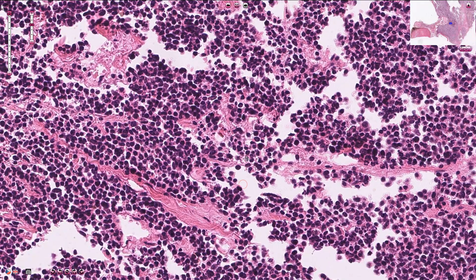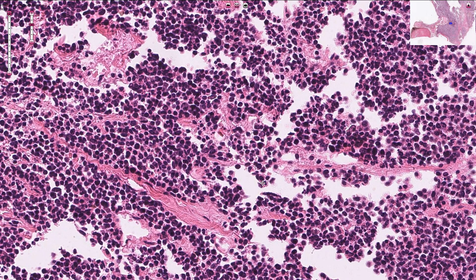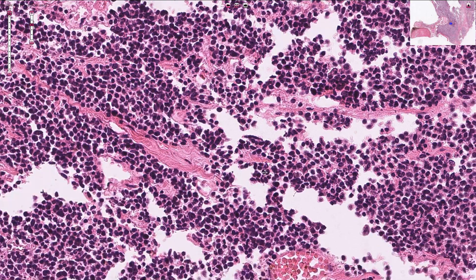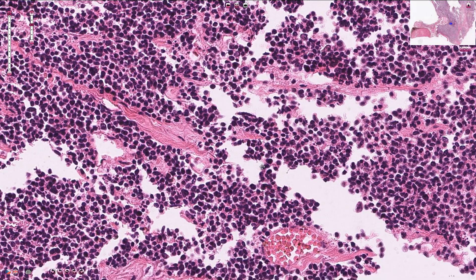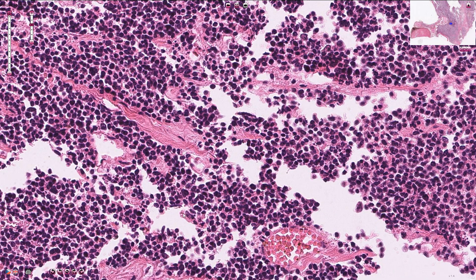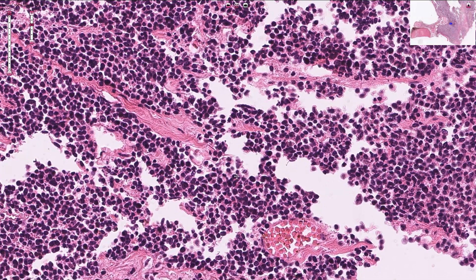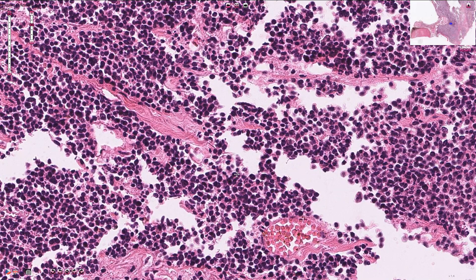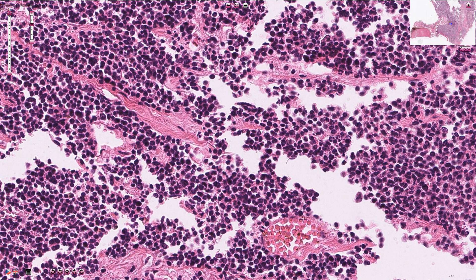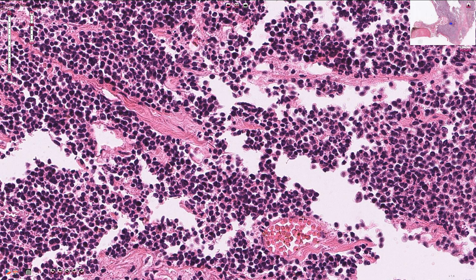Synaptophysin and chromogranin are positive in neurosecretory granules of these cells, and the positivity proves that these cells have neuroendocrine granules and that they are of neuroendocrine origin. The nuclei are also sometimes compared to oat flakes or oat cells because of the oval shape of the nuclei.